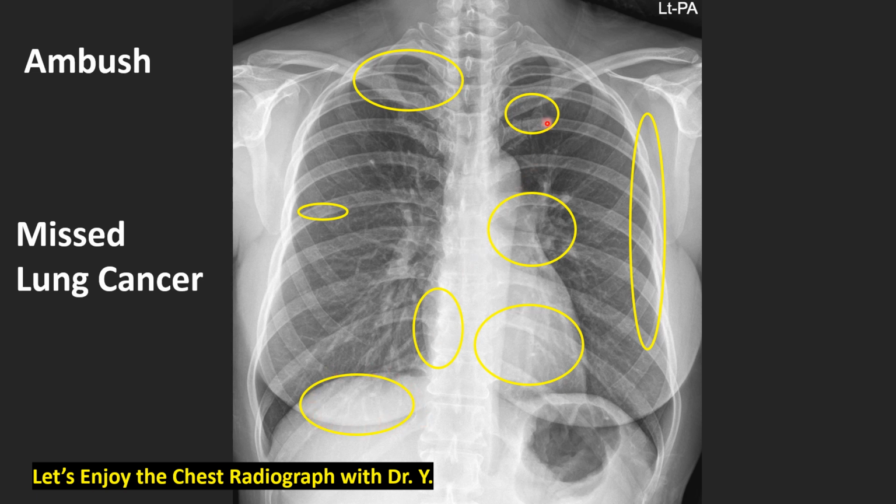And on this one, the first costochondral junction. Sometimes we call this area student tumor. The most important area where accidents occur so many times, so many cancers are hidden here. Most important focus, hilum, retrocardiac area, and also the lateral portion.